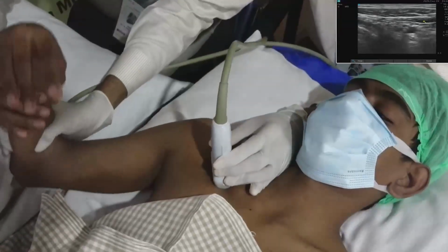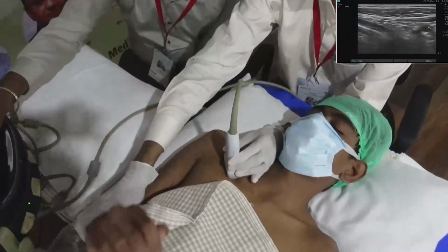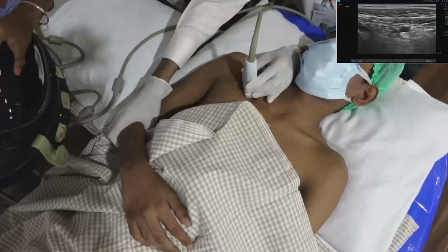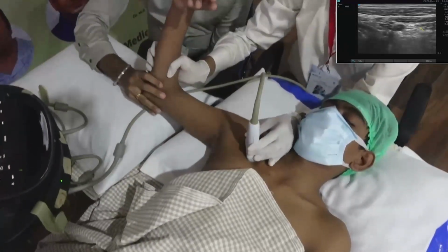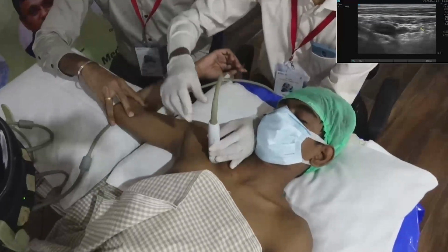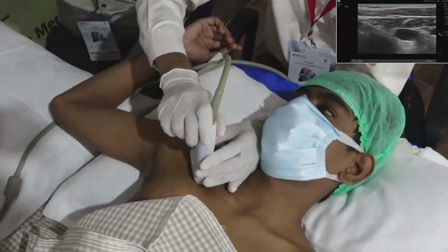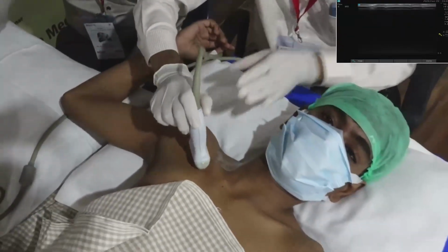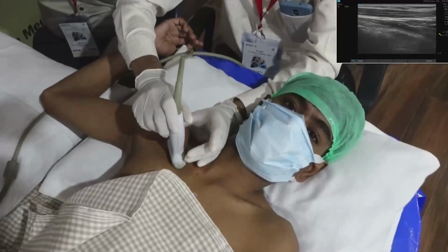If I start abducting, you can see the neural elements. Even if I have difficulty keeping the probe in the adducted position, the moment I abduct the arm, the neural elements are very clear. So here it is very important to scan the vessels, then muscles.